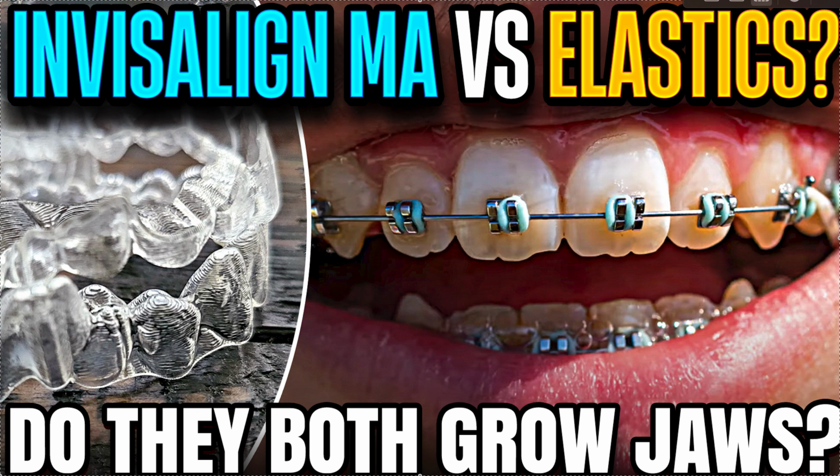You can look up your own research. But yeah, it's completely different. If you are looking for airway benefits, elastics is not it. Of course, you want to get the airway benefits from expansion, skeletal expansion, and positioning the lower jaw, as well as more profile benefits will come from the MA. So things to keep in mind: if you're not looking for a stronger jawline, then don't do MA. Then elastics might be a better fit for you.